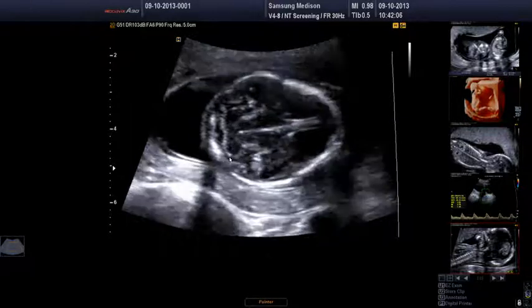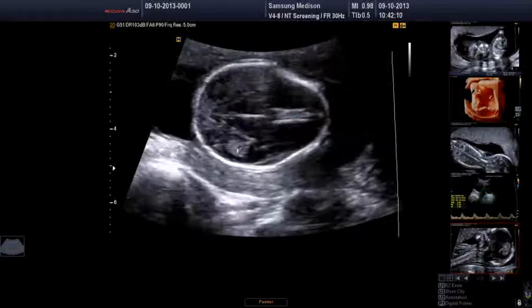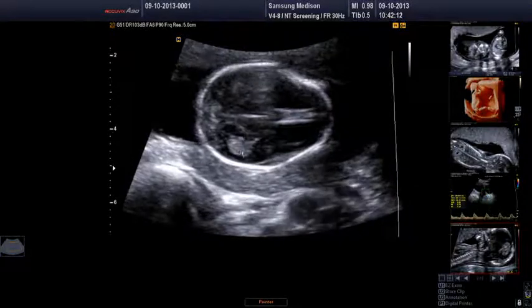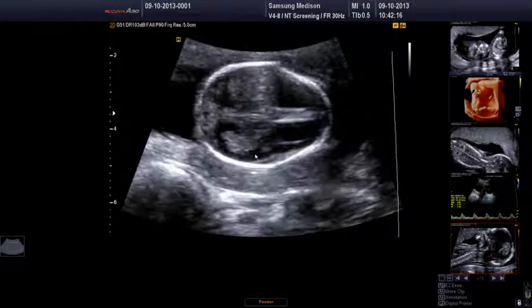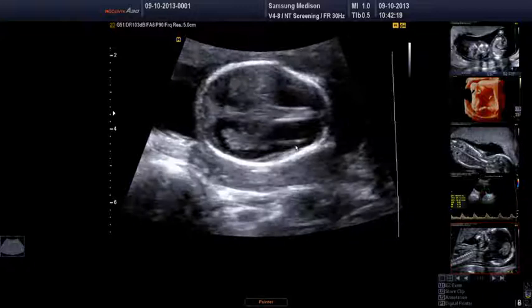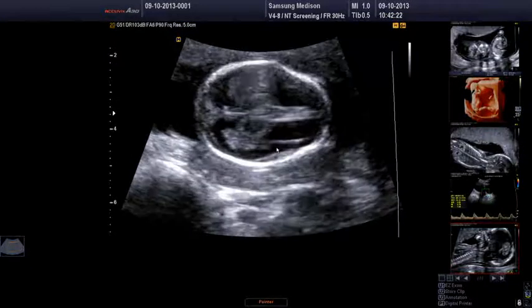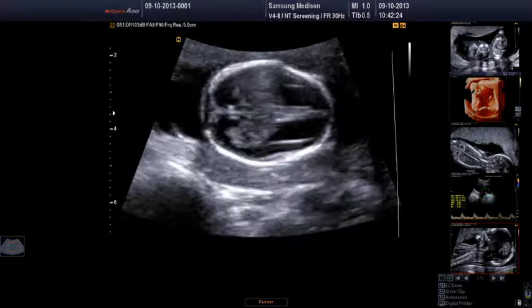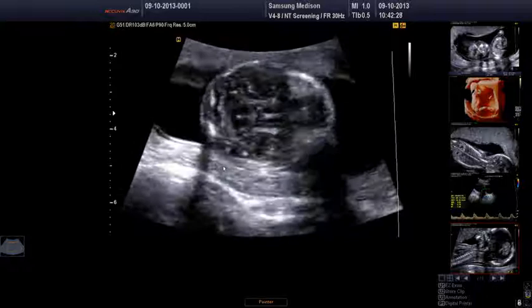In the first trimester, the posterior horn of the lateral ventricle is really quite large in relation to the cerebral mantle, and also the cerebral mantle, which you can sort of see coming around the edge here, has a very high water content, so you can see it's very lucent at this gestation.